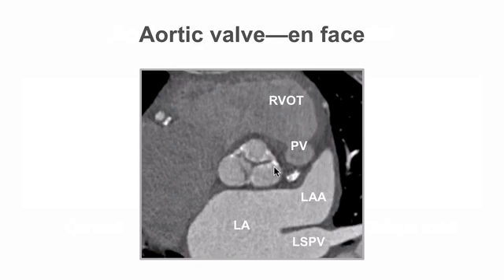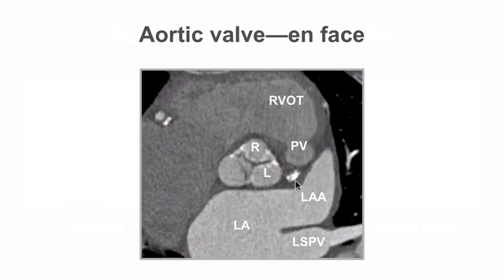This slide shows the relevant anatomy at this point. We can see the left atrium, the left atrial appendage, the left superior pulmonary vein, along with the right ventricular outflow tract and the pulmonary valve. This is the right coronary cusp of the aortic valve — the most anterior of all three cusps. This is the left coronary cusp from which the left main stem arises, and this is the non-coronary cusp which lies adjacent to the interatrial septum.